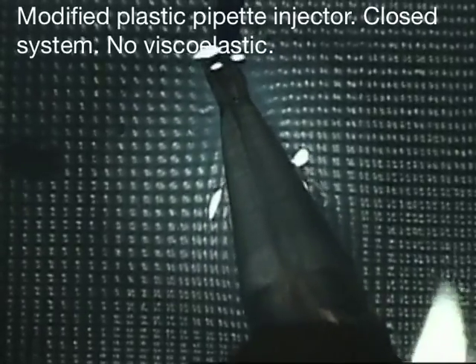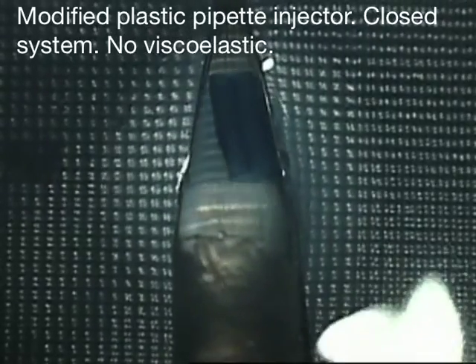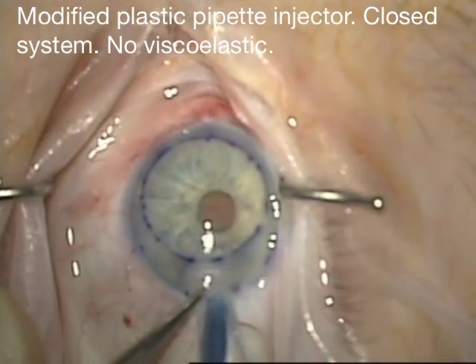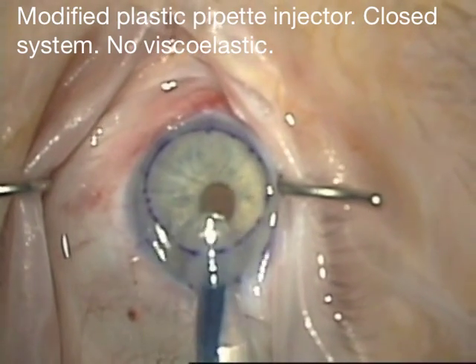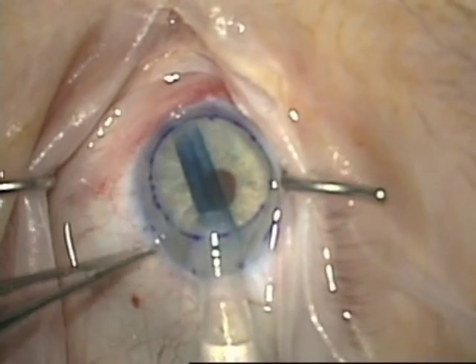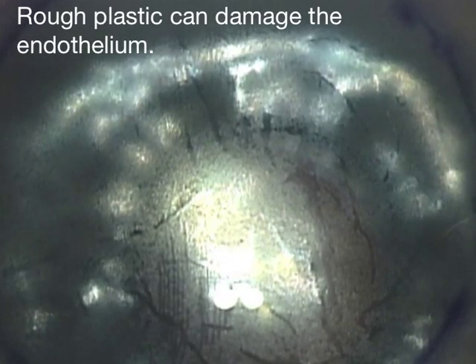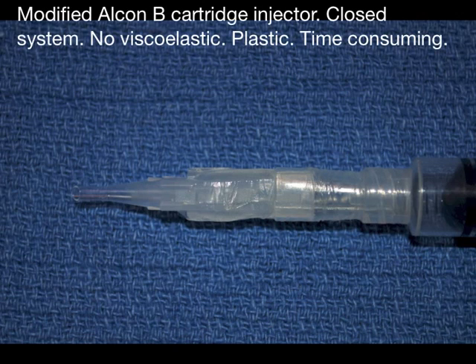I made a modified plastic pipette injector, which is a closed system, uses no viscoelastics, and can work very well for graft injection, but does have some downsides, such as plastic that can damage the graft. And you'll see that here — you can see actual endothelial damage in an area that looks like bear claws.